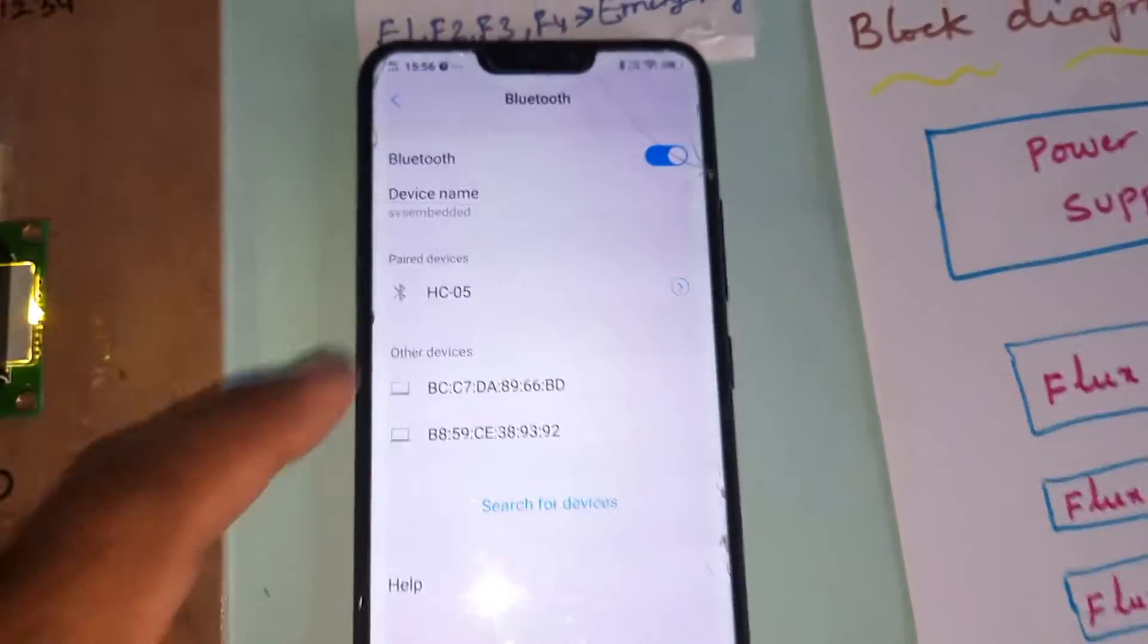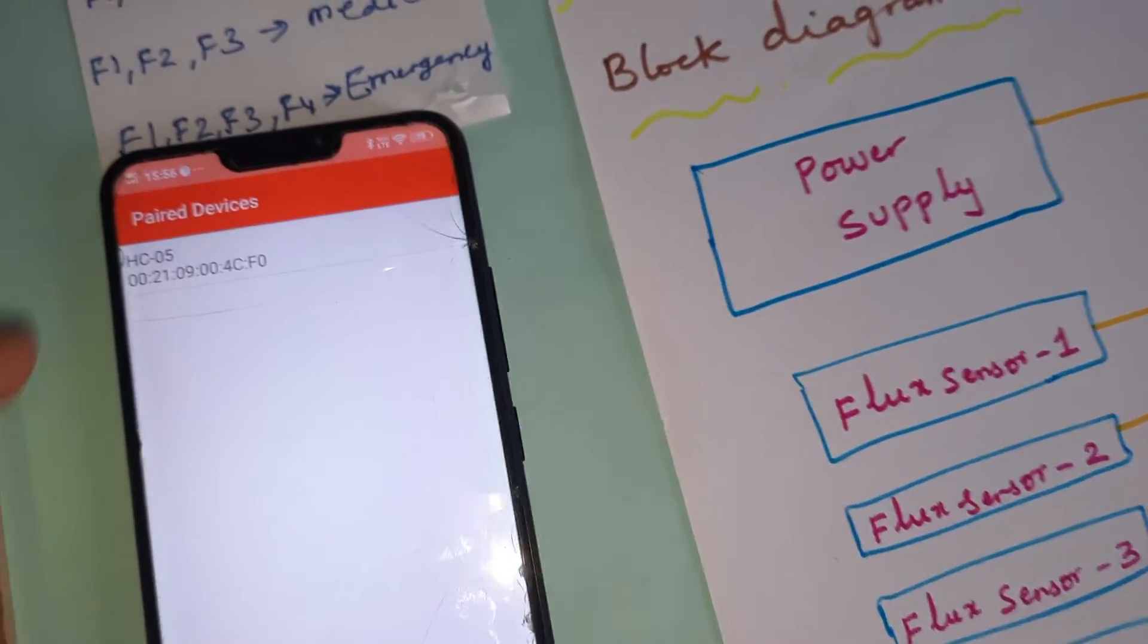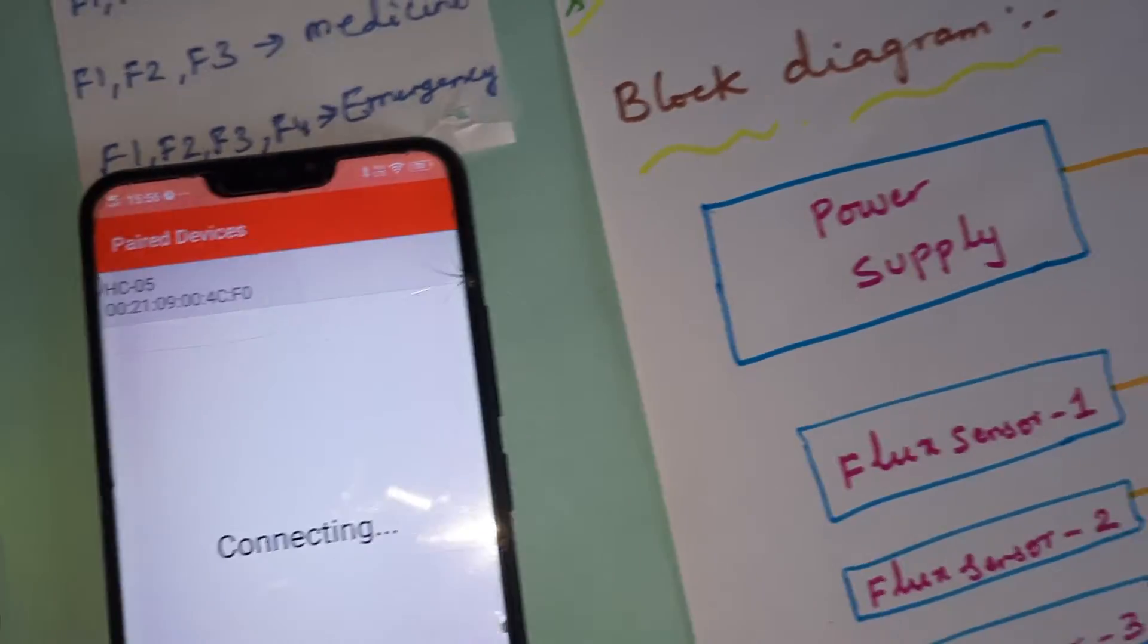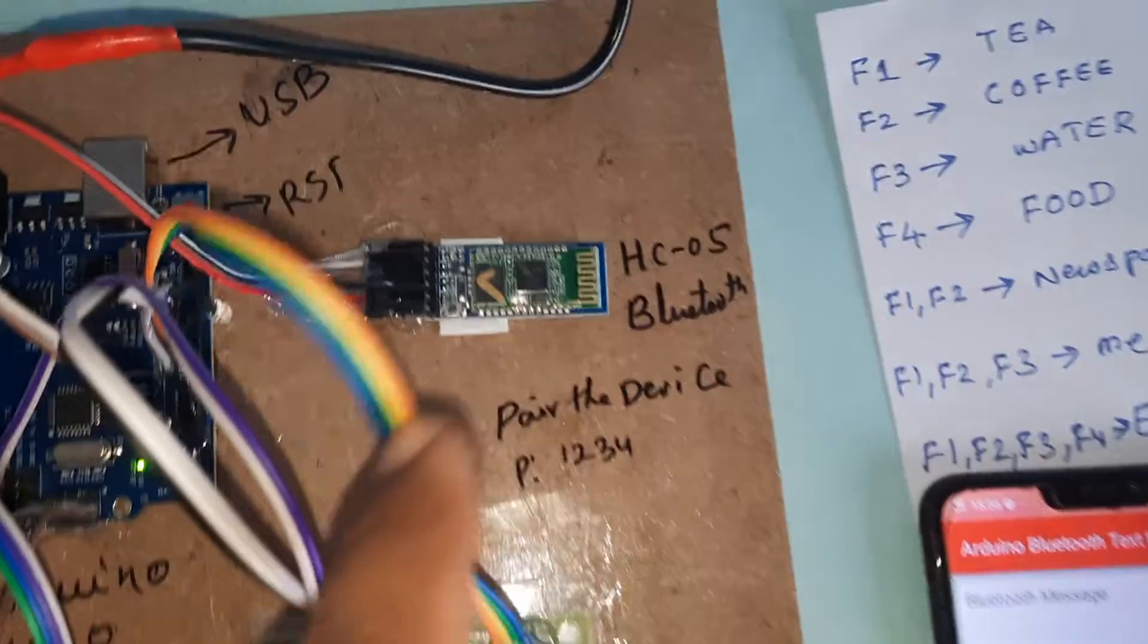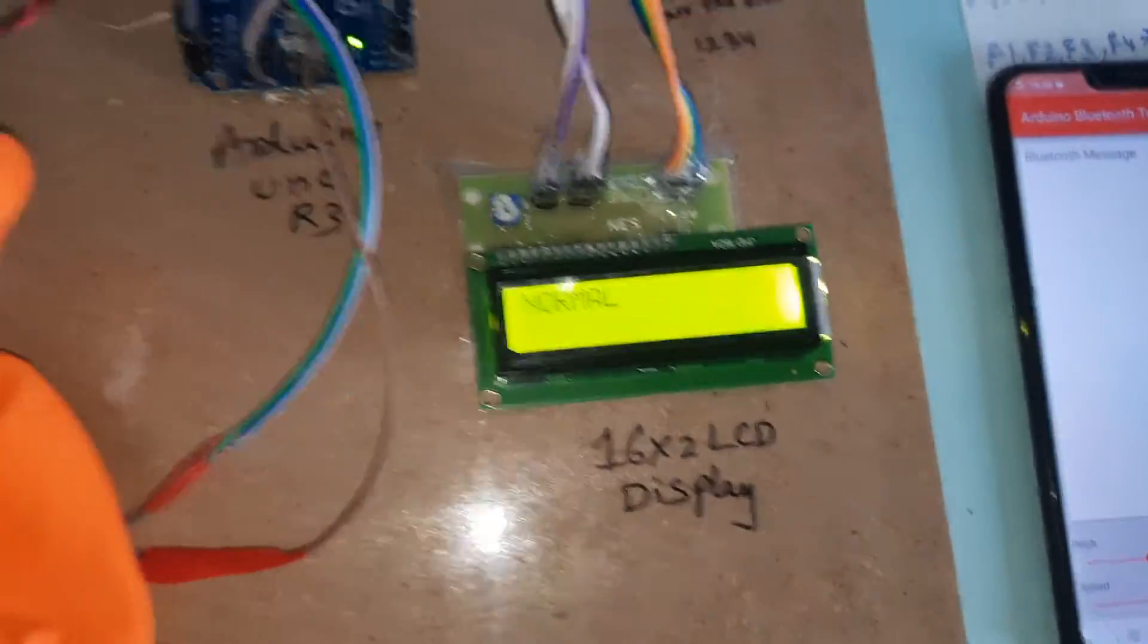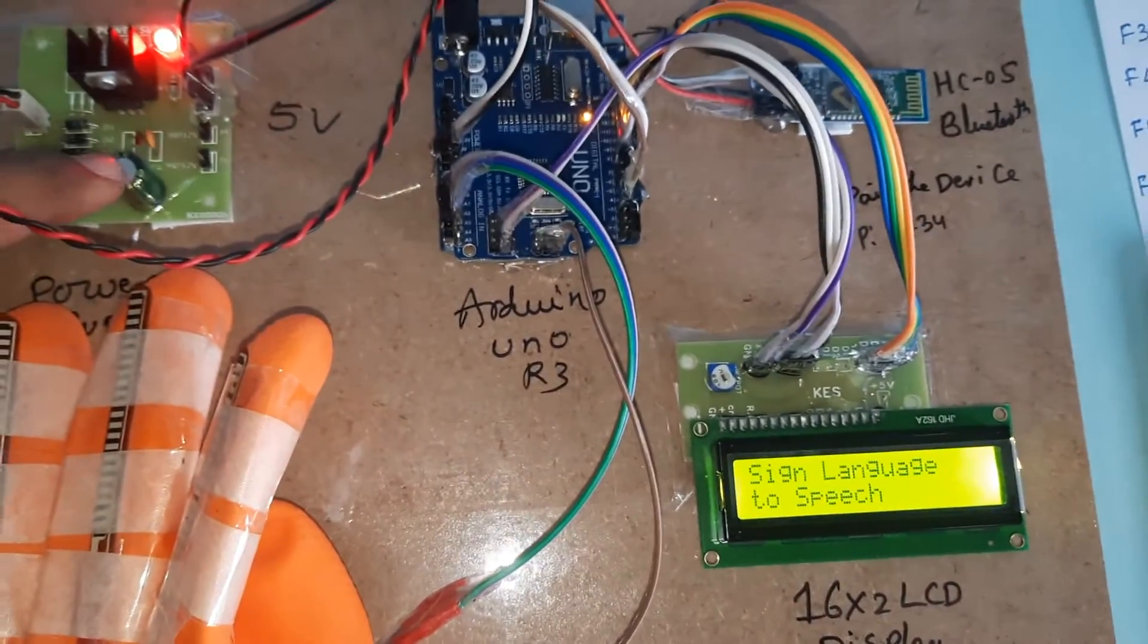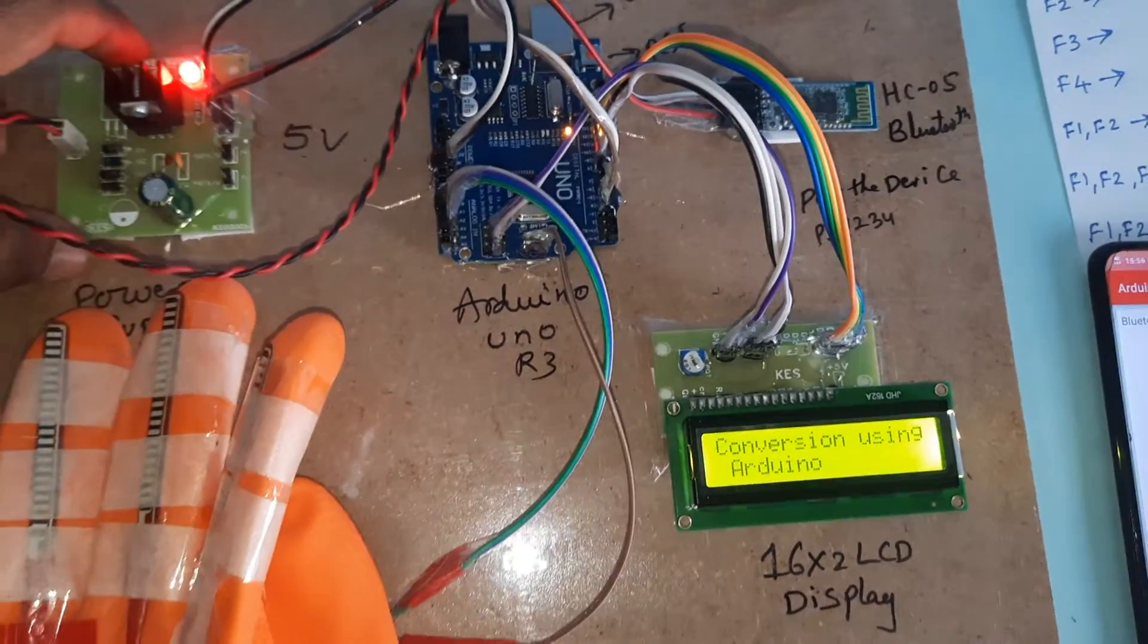Password is 1234. HC-05 is paired. Then go to app. HC-05 is there, click it, connecting, connected. LED is on. Go to press. Here - bridge rectifier, filter capacitor, 7805 regulator, one LED power supply board, Arduino Uno R3, 16 by 2 LCD display.